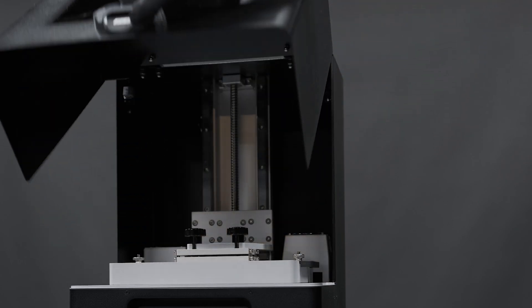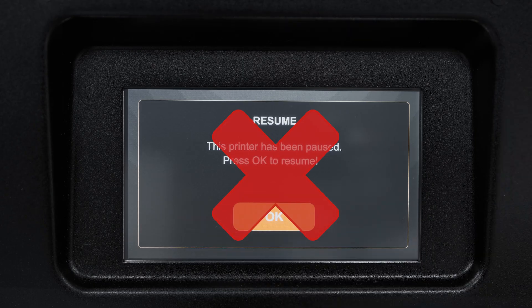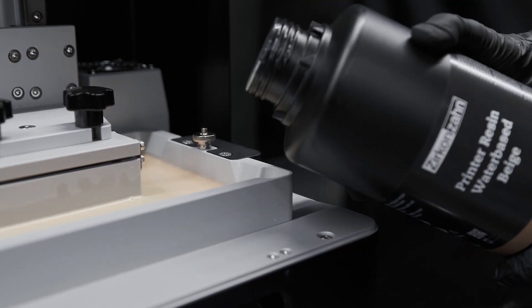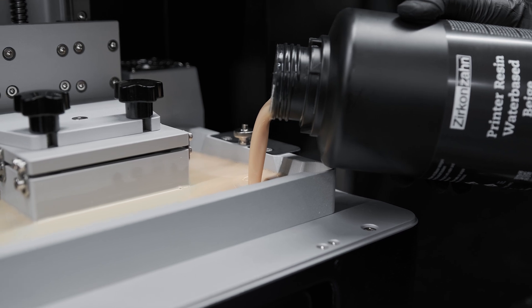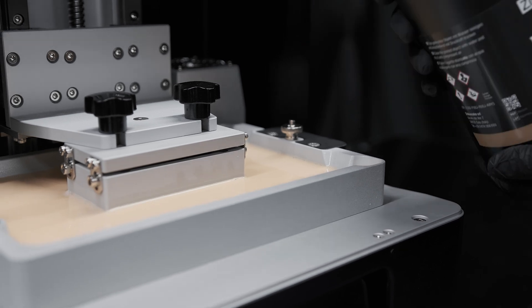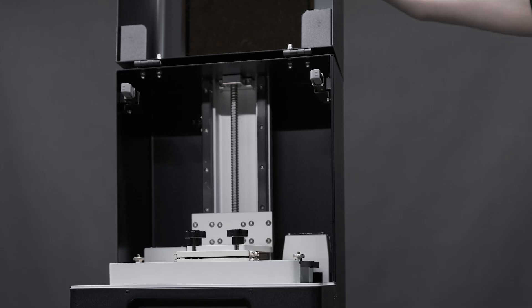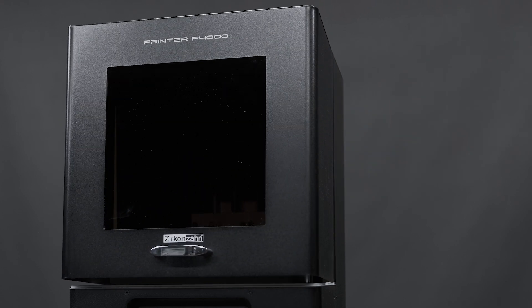Open the printer chamber but do not pause the printing process. Then pour the resin slowly into the vat as the building plate moves up. Once the resin vat is refilled, close the printer chamber.